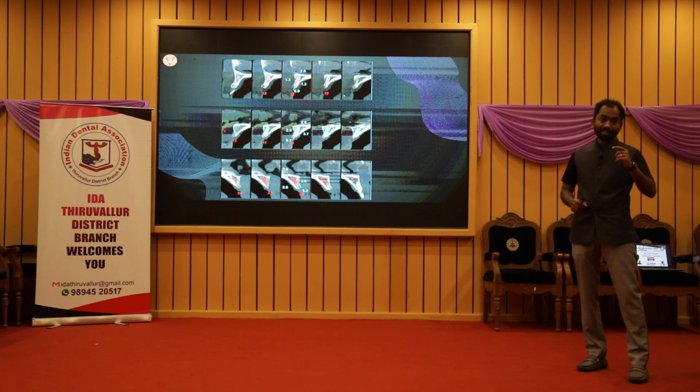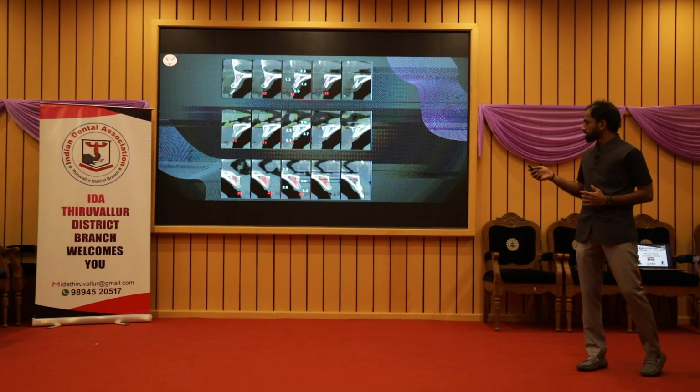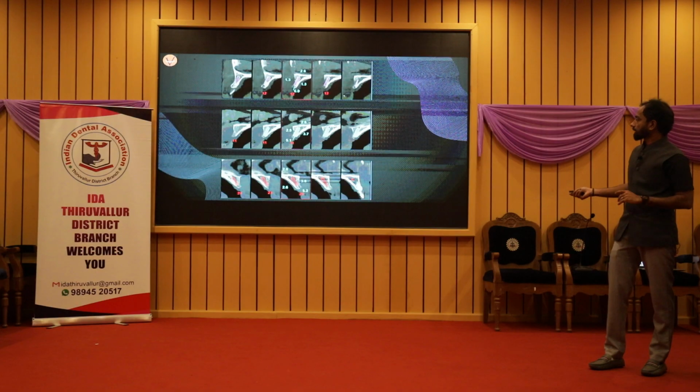And one more thing, it doesn't create any heat. It will condense the bone nicely. So that was one way to go. So any maxillary case, after the pilot drill or one more drill, I'll go next with your Densah bur.